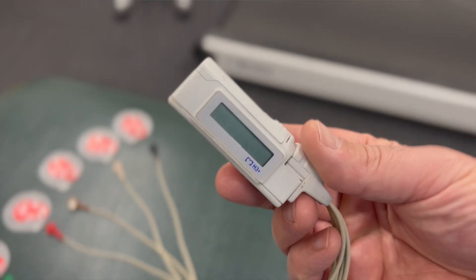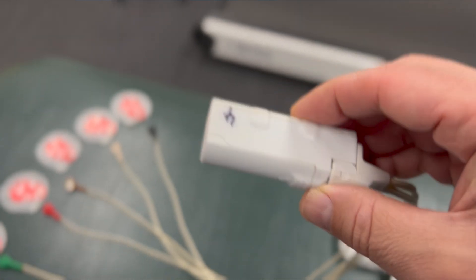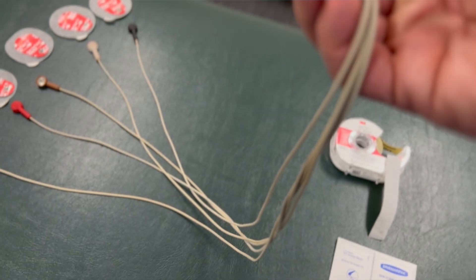The electrodes are connected to the leads, and they are connected to a small recorder. That recorder is variable — there are different models and brands around, but they can be quite small as you can see here. And that is discreetly worn under your clothes.